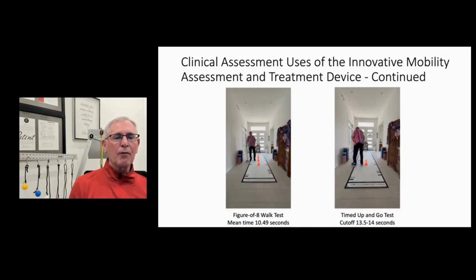You see he definitely is outside 2 foot to the left and the right. So on a handicap width sidewalk of 48 inches, he would definitely need all of that to stay upright. He does get back to the chair. He does a nice pivot turn here, and then he turns, will reach back and grab the chair and return to the seated position.